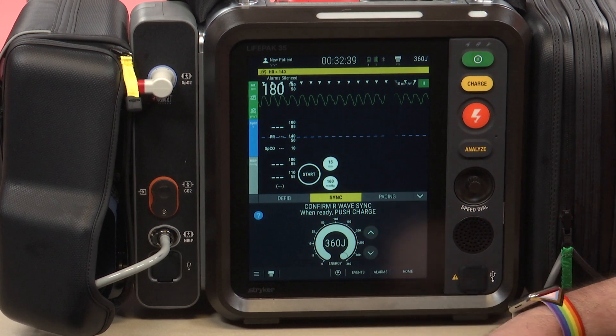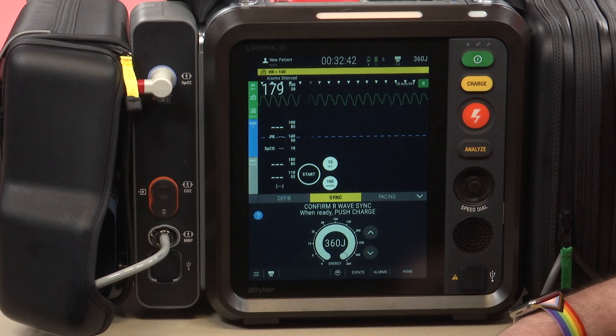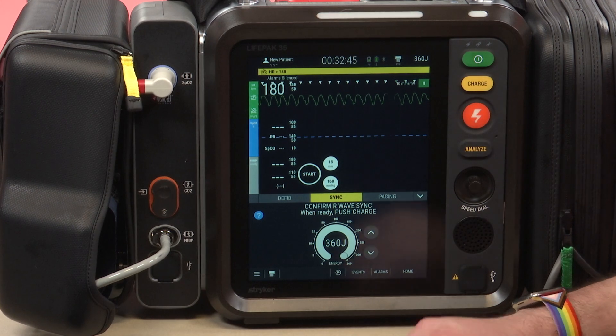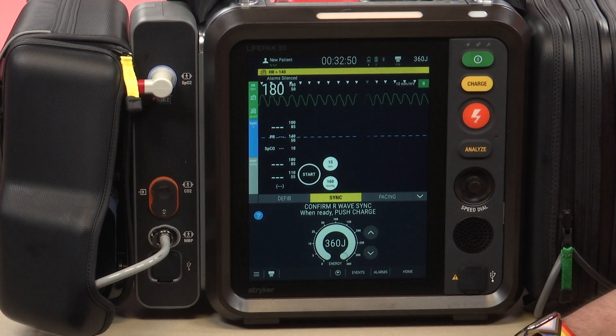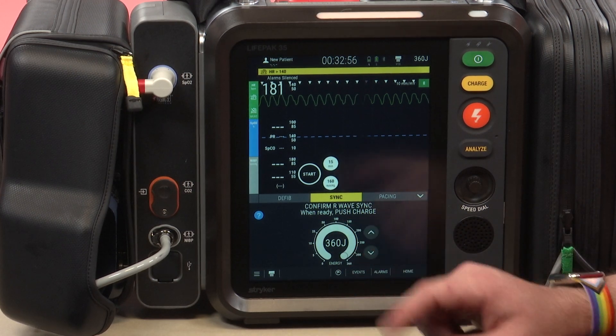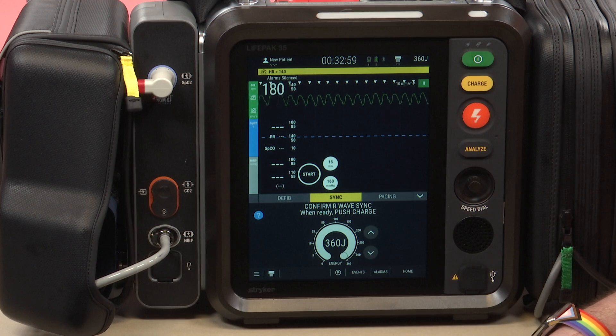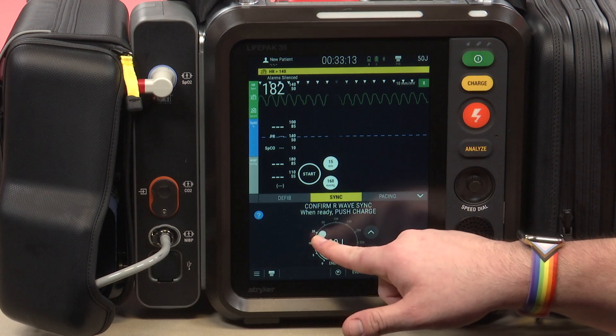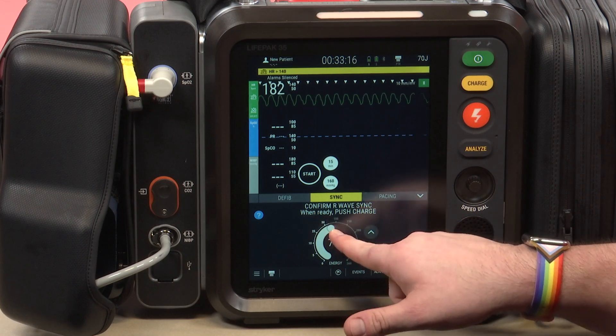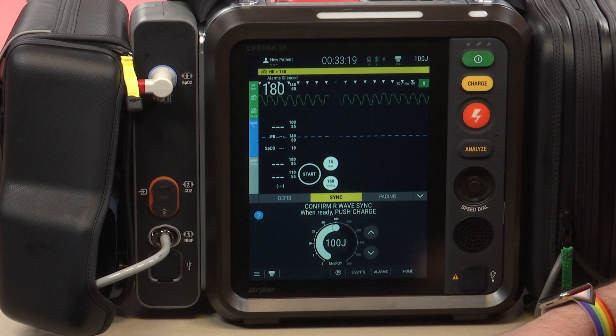Here at the bottom, because our energy is automatically set to 360 joules for defibrillation as per Maryland protocol, it comes up that way here as well. Remember, that is certainly not the initial cardioversion energy that we're using on patients — I'm going to have to adjust this. For rhythms such as SVT and VTAC, we're going to initially cardiovert those patients at 100 joules. I'd back that down to 100 joules for adults.